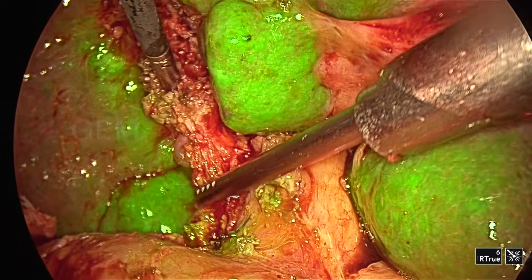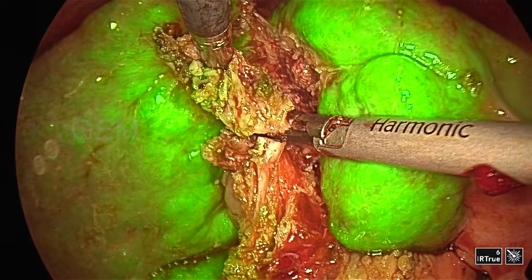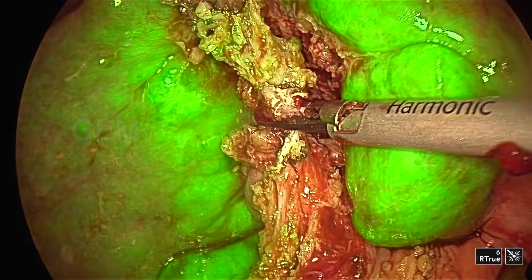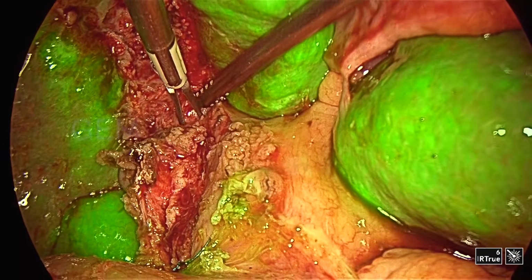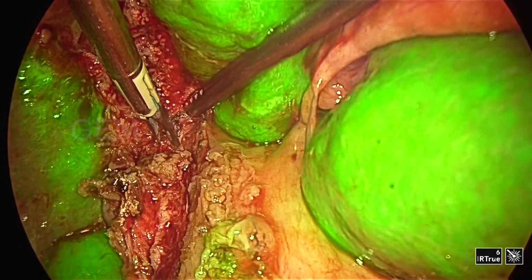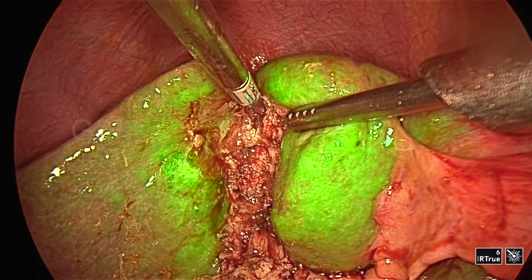The mucosa of the cystic duct is to be cauterized. This is the excess infundibulum, sorry, the cystic duct is excised, and you can see the right duct very well, and I am just coagulating the mucosa of the cystic duct with the bipolar forceps.